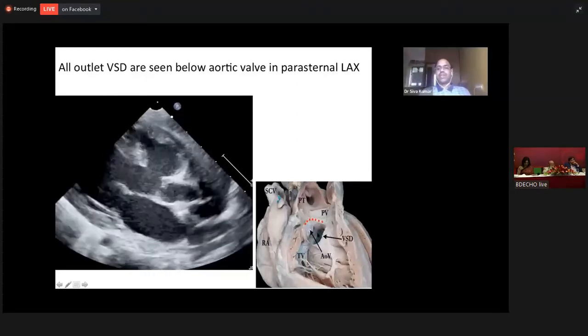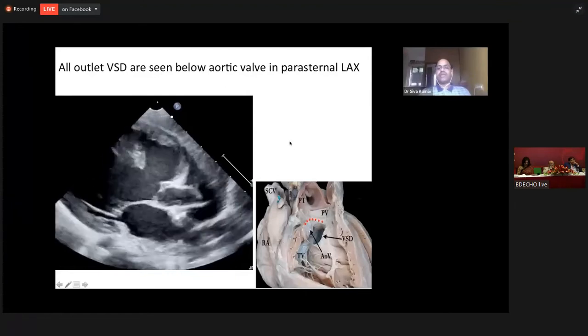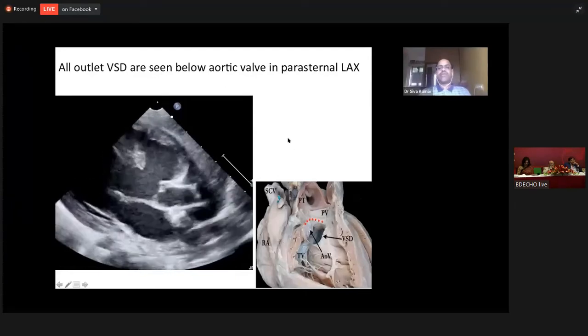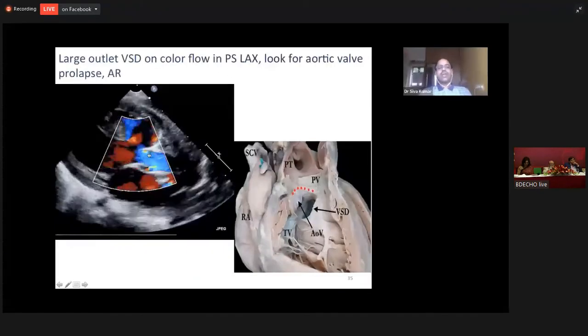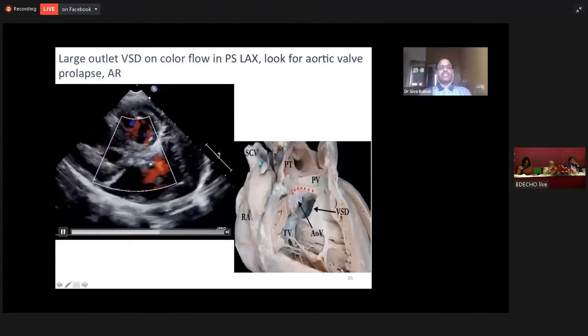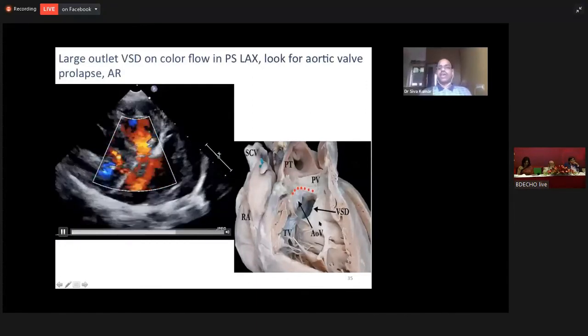This is the color flow Doppler of a parasternal long-axis view. Immediately below the aortic valve, you can see the large VSD and the same cartoon example.